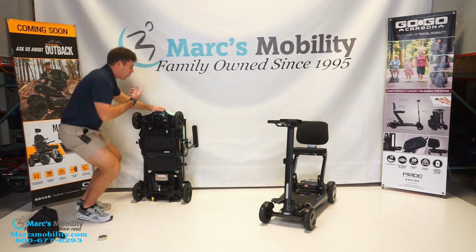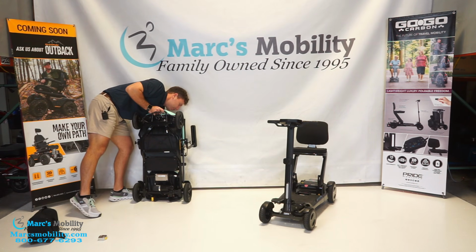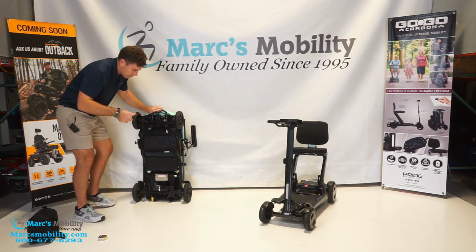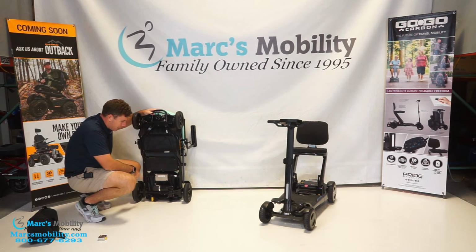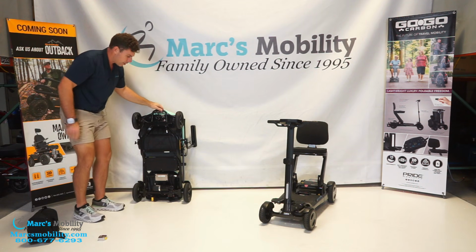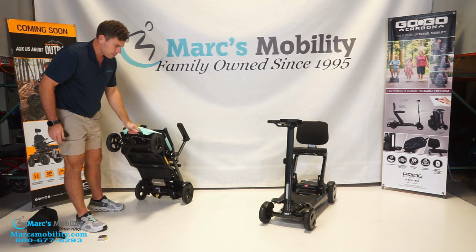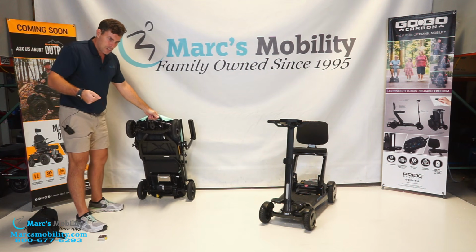lever up. Why the unit is beeping right there is I actually had this scooter still on. So there's nothing wrong with the scooter, but when the scooter's on and you've changed this little lever from freewheel into the drive mode, it is going to beep at you and say it does not recognize the brakes. And now from here, you do have some resistance on the motor still, so it's not going to be the easiest unit to roll around.